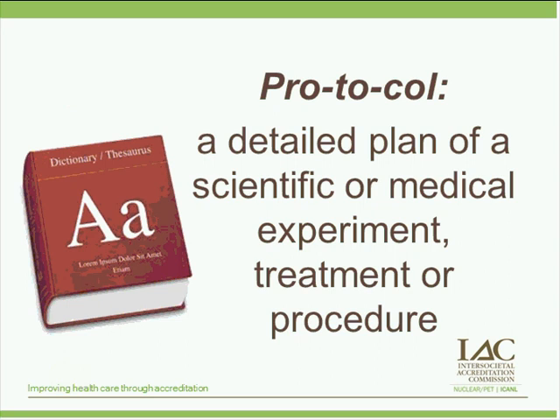So let's start with the definition of a protocol. A protocol is a detailed plan of a scientific or medical experiment, treatment, or procedure. Protocols detail exactly how a test should be performed and are critical in standardizing operations in a facility. There are specific elements or sections that must be included in any protocol.